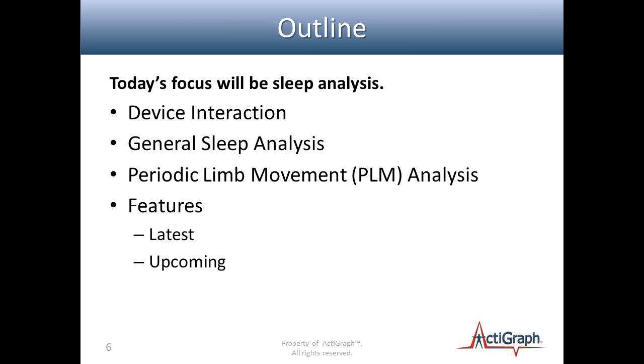So today's outline for what Richard will be talking about: a few things: device interaction, how you need to set up your devices for sleep, where to wear it for sleep, some general sleep analysis. We'll go through our tab in ActiLife on how to add sleep scores and do some automatic scoring that we provide. Also, we'll talk about the periodic limb movement tool that we have in ActiLife, and we'll also show a few of our latest and upcoming features.